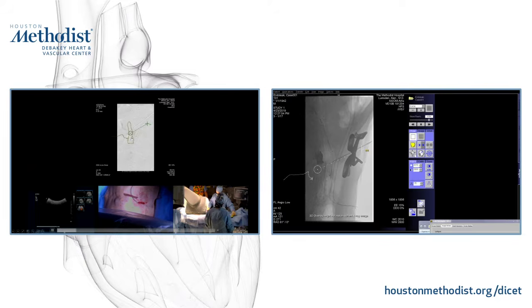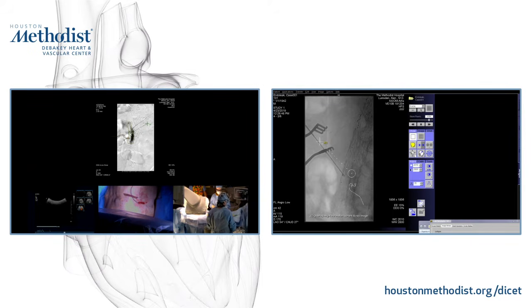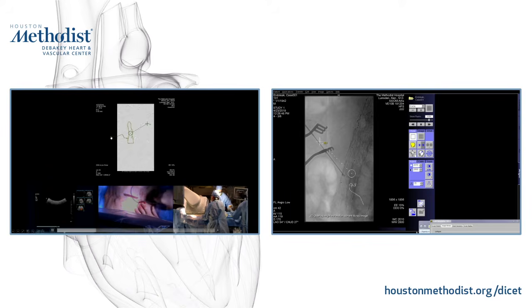Okay, let me blow your trumpet a little bit. That little squiggly line on there was where you predicted this lumbar artery was going to be off the CAT scan in a fused image. And so this was one of these eureka moments in the operating room, where you started jumping around going, can't believe that fusion is that accurate.